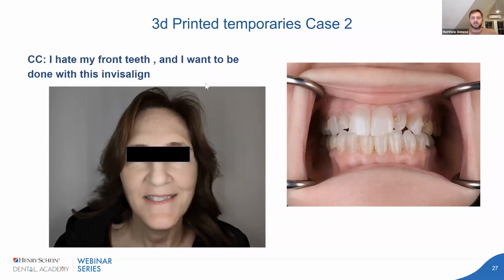So case number 2, this is another ongoing case. This patient happens to be my mom's boss, which always adds a little bit more pressure. "I hate my front teeth and I want to be done with Invisalign." So a couple things we can fix, a couple things we can't fix.